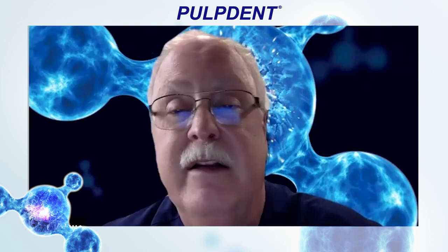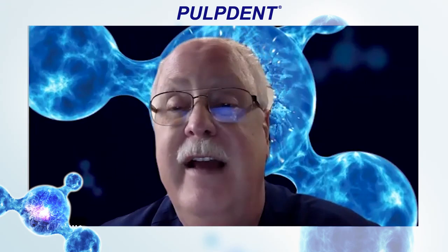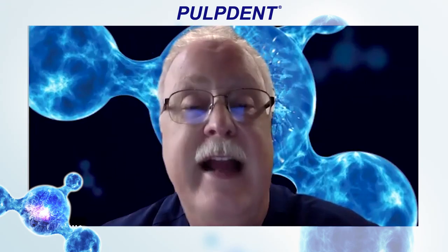We can't feel a 30 micron margin with the sharp explorer, but that doesn't mean that there isn't a gap, because bacteria are 1 micron in diameter. So 29 of those little bacterium can crawl right under a margin that has cement washed out or has a void or what have you, and gain access to the internal aspect of the restoration in the tooth.